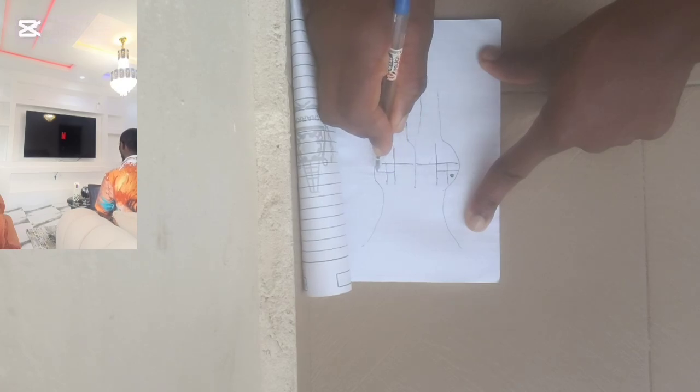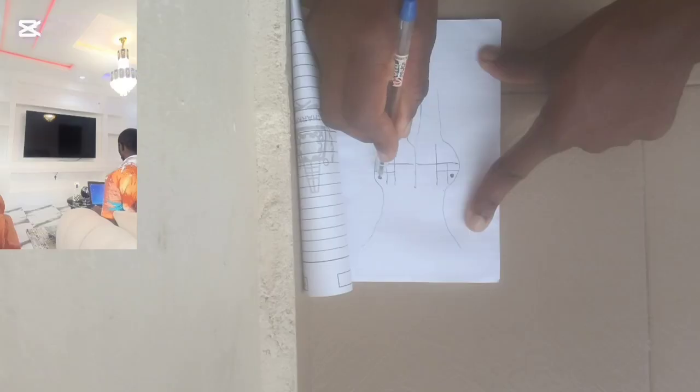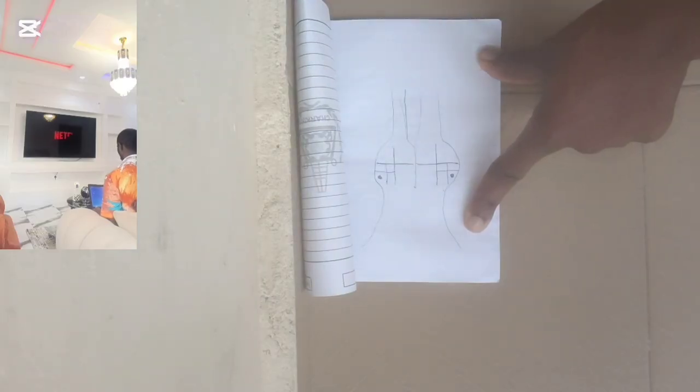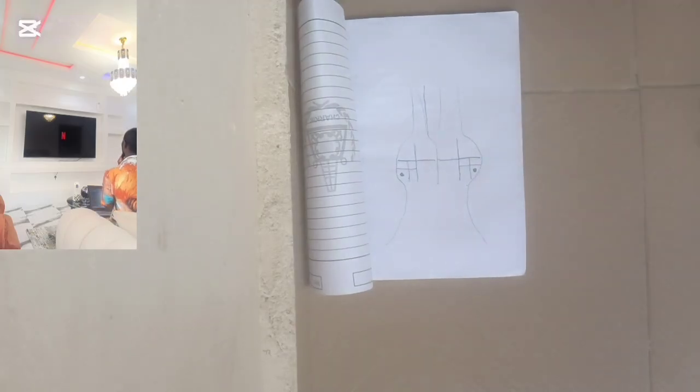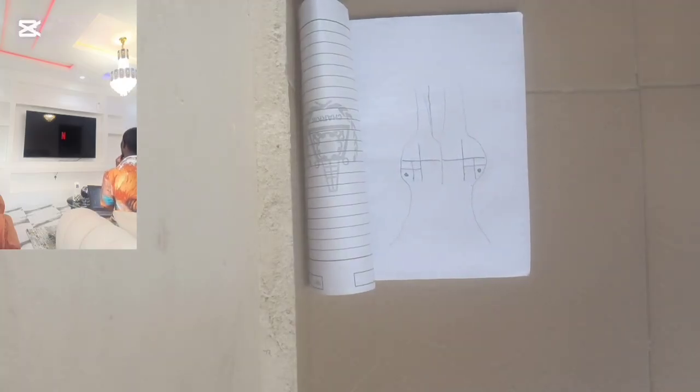There are two differences here. If you are giving on the right side, you have to differentiate carefully from the sciatic nerve endings.